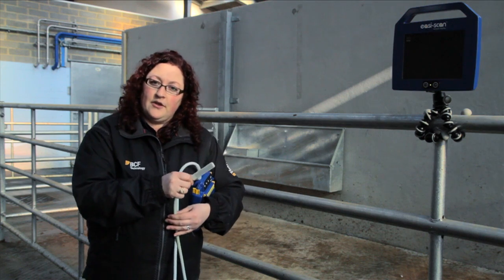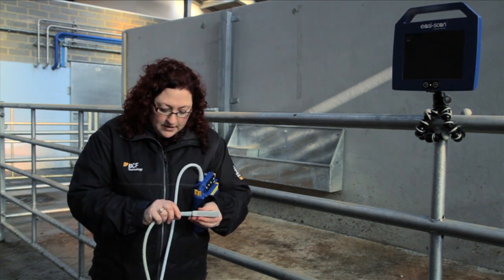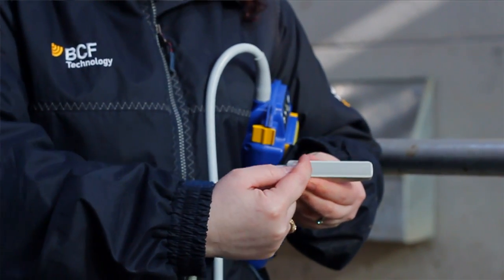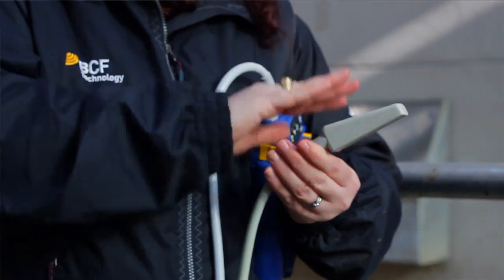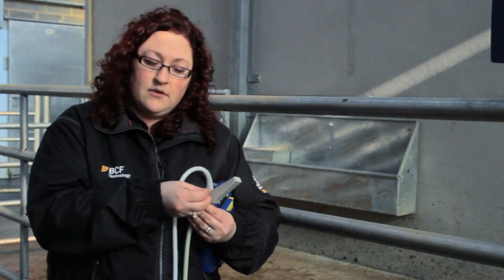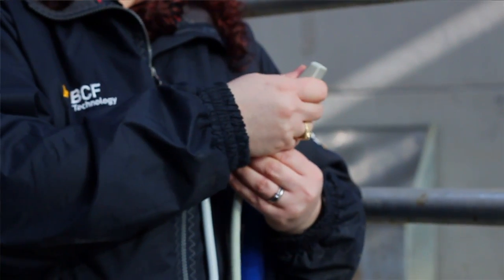This is a rectal probe, which is a linear probe. Along the face of the probe are ultrasound crystals. Electricity runs down the cable and causes these ultrasound crystals to vibrate. When they vibrate, they release an ultrasound wave which travels down into the tissues, bounces off structures, and is returned back to the probe. That signal is received by the console and translated into an image.